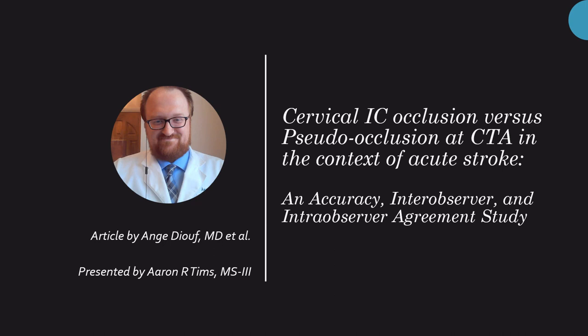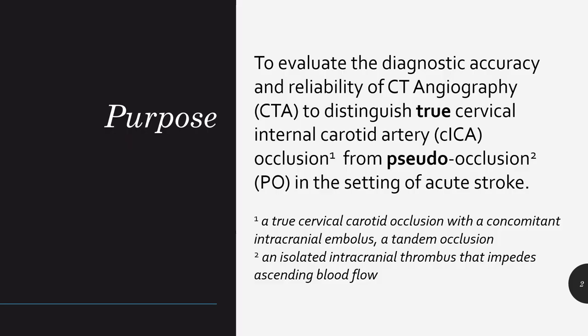This article that we're covering is cervical ICA occlusion versus pseudo-occlusion at CTA in the context of acute stroke: accuracy, inter-observer and intra-observer agreement study. The original article was by Angie Diouf and her colleagues.